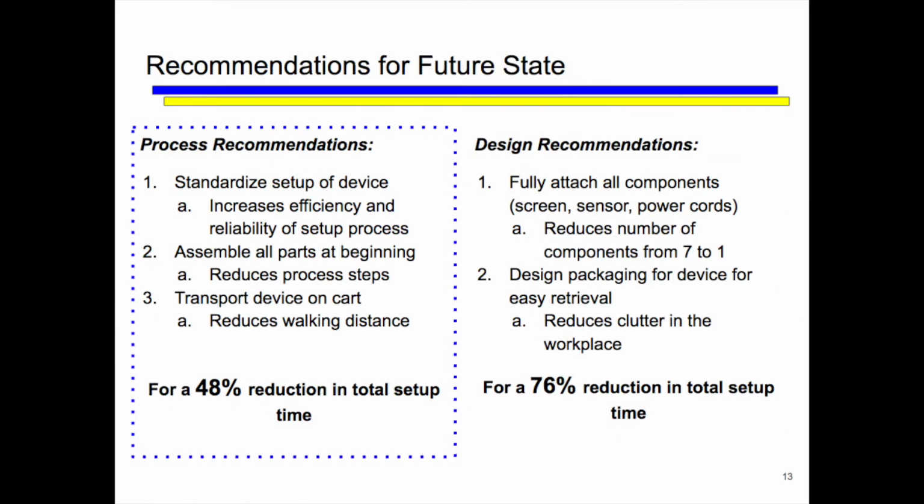We have created 2 different sets of recommendations for the future state, the first being process recommendations and the latter being design recommendations. For the purpose of this class, we are focusing mostly on the process recommendations. First, we are recommending the standardization of the setup of the device, and this would increase the efficiency and reliability of the setup. Also, we are recommending to assemble all the parts at the beginning of the process, reducing the total amount of process steps, and to transport the device on a cart, thereby reducing the distance walked. This resulted from our time study in a 48% reduction in total setup time.